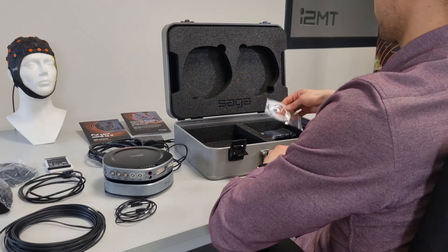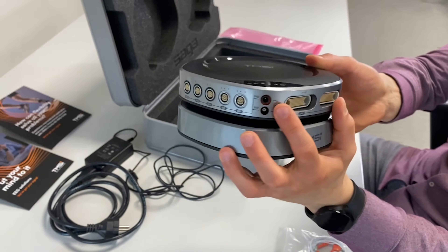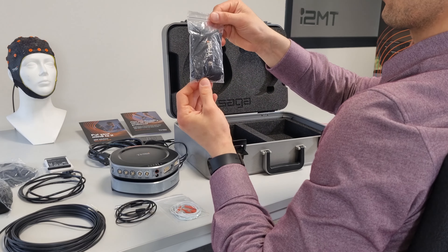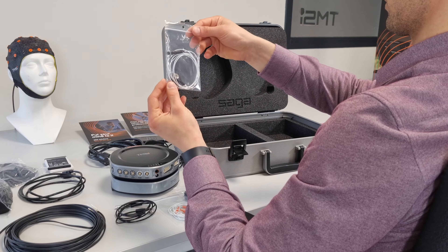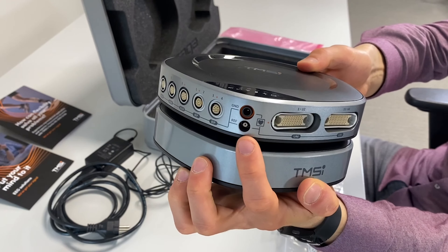The patient ground lead can be recognized by its orange color, and a spare patient ground lead is provided. The patient ground should be connected on one side to the data recorder and on the other side to the wristband, to keep the amplifier in range during measurements. The black cable is a common reference cable that can be used when a separate electrode is used as a reference, and should be connected to the data recorder when in common reference mode.